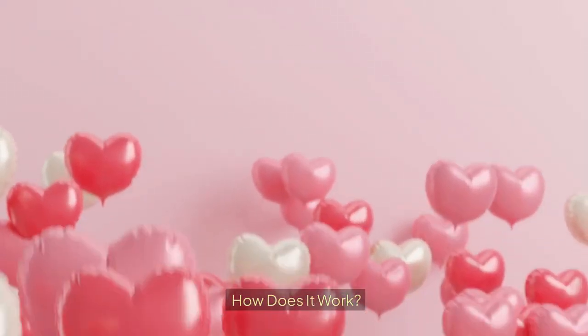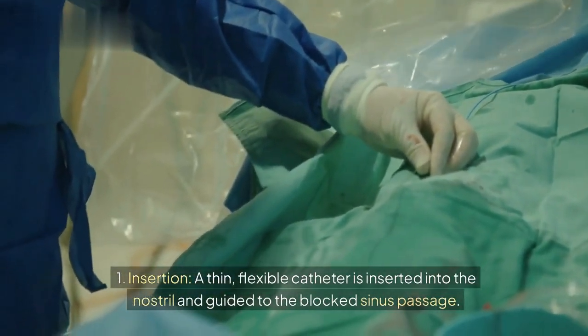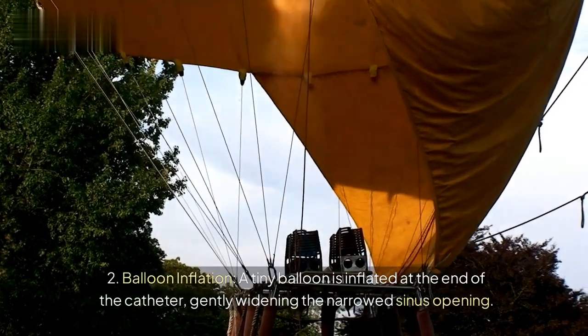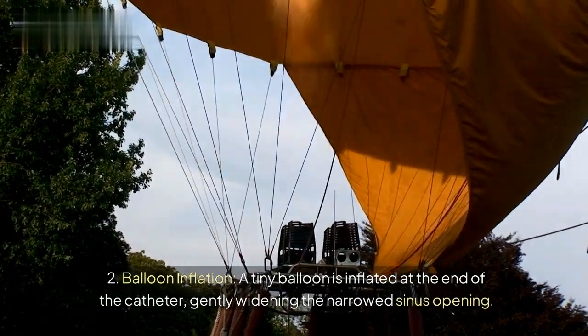How does it work? 1. Insertion: A thin, flexible catheter is inserted into the nostril and guided to the blocked sinus passage. 2. Balloon Inflation: A tiny balloon is inflated at the end of the catheter, gently widening the narrowed sinus opening.